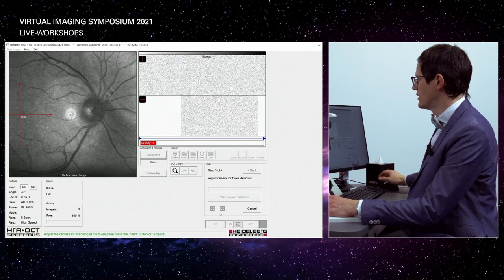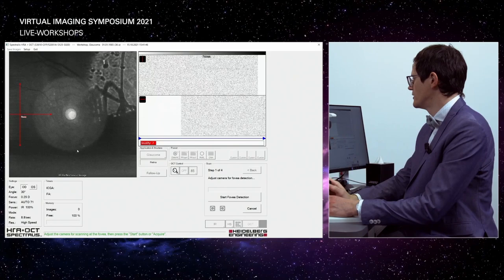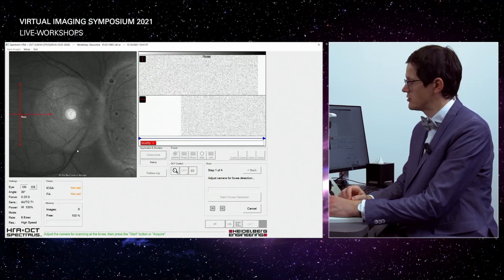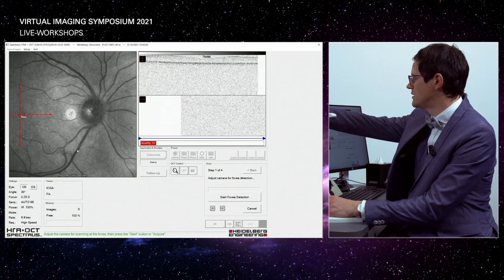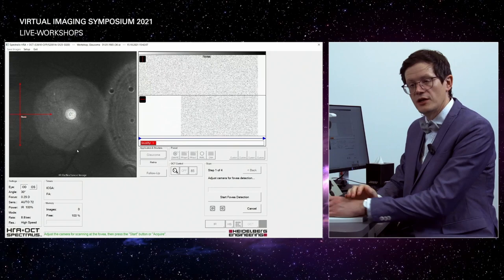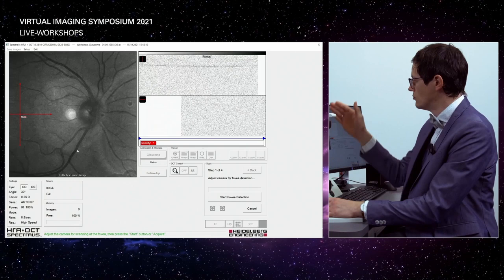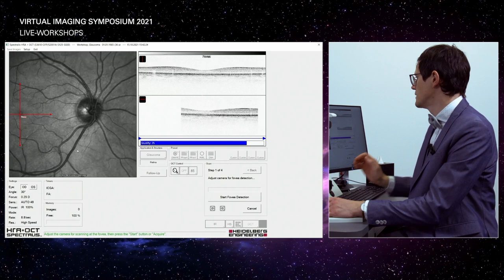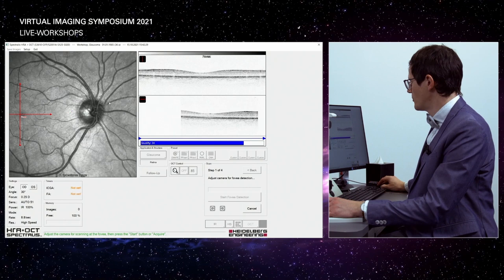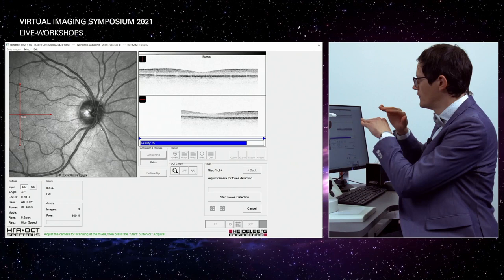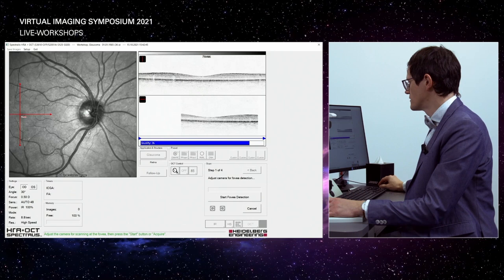The fixation target moves from center to nasal and the image gets worse — because my patient very helpfully already looks toward the fixation target. If patients have trouble seeing the fixation target, you can hold your hand next to the patient's open eye so they can see the fixation light reflected there. You also need to move the camera slightly to the nasal position to illuminate the picture and check that the structures surrounding the optic nerve head are sharp enough.